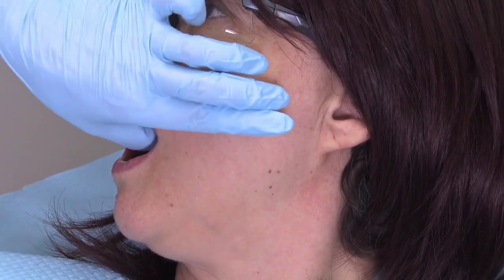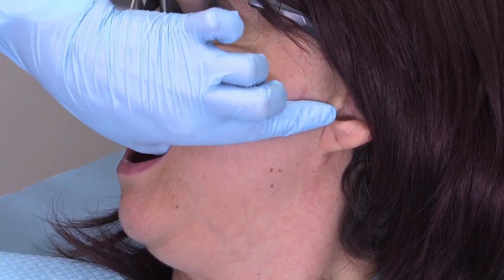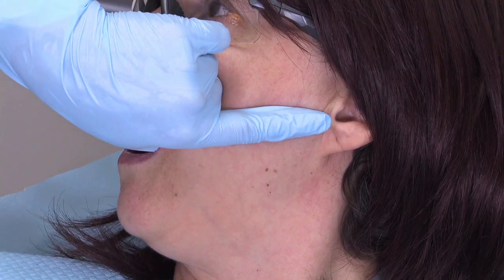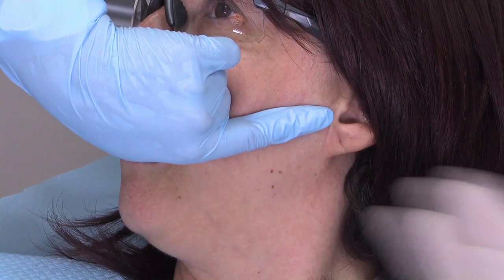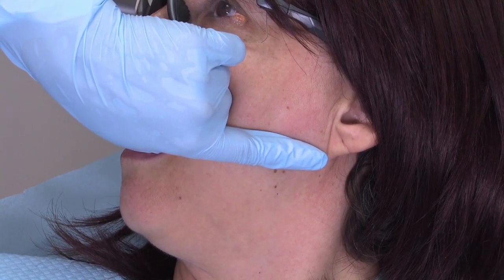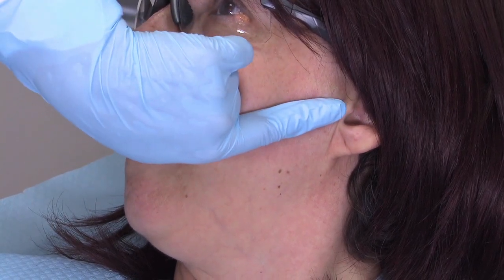One of the things I find really helpful when I'm palpating is I'll actually put my finger right there at the tragus notch, and then as I pull back I'm kind of lining my finger up and giving myself that orientation. You're actually seeing that angulation for yourself now with your finger. Yeah, because otherwise I'm used to lining up the standard IA and my brain's going to take me there, but I want my brain to go up here instead.